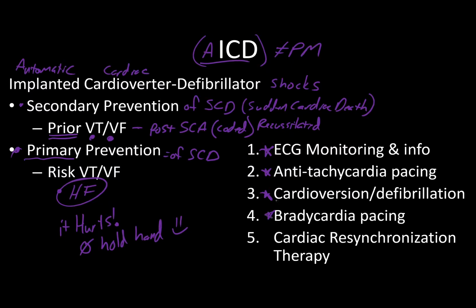Bradycardia pacing. Now, in this scenario, it is entirely possible for a patient to have a pacemaker and AICD. And that's a very, very common thing and an important question to ask: hey, do you just have a pacemaker, or is it capable of delivering a shock? Sometimes patients know, sometimes they don't. But if you're looking at the records and can figure that out, that's very helpful. And the combination of the two is absolutely excellent for these types of patients who have very poor heart function.